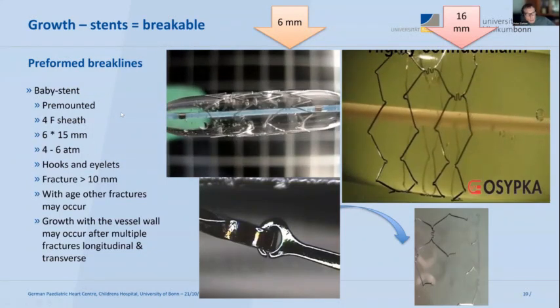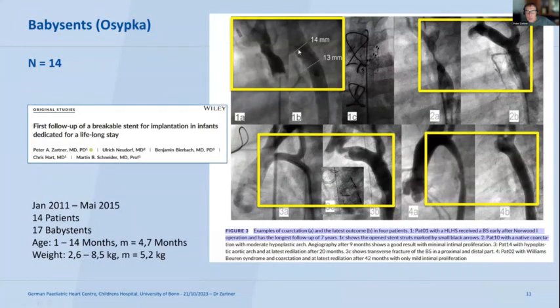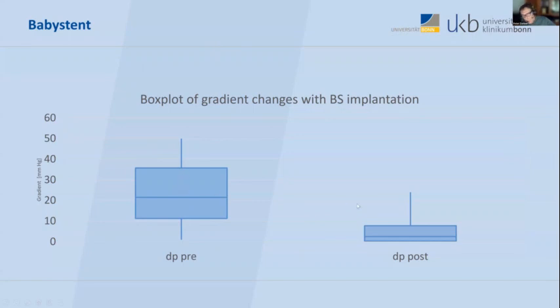These are our first patients. You see the stenosis and the late results. This is a very tight stenosis with a good result. This is a more or less hypoplastic arch, which nicely had grown over time. And this finally is Williams-Beuren syndrome, also with a good final result, just implanting a growth stent, no surgery needed in these patients. We also get an immediate good result after implantation.